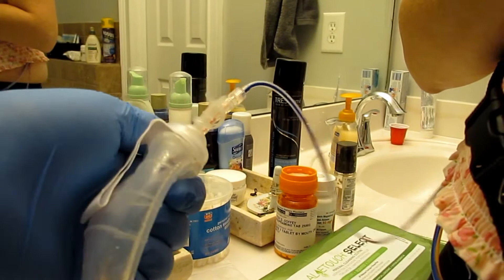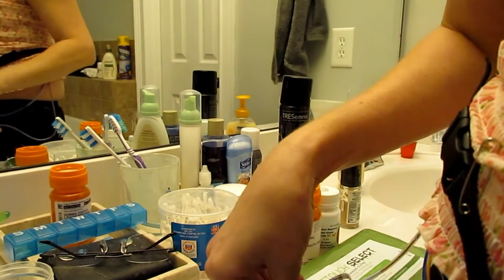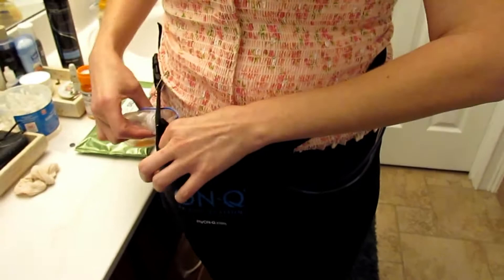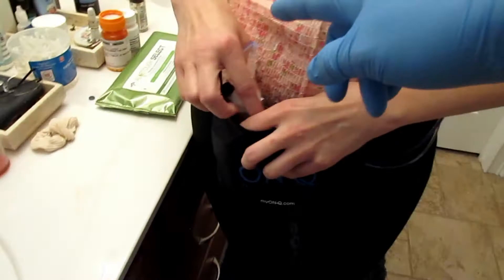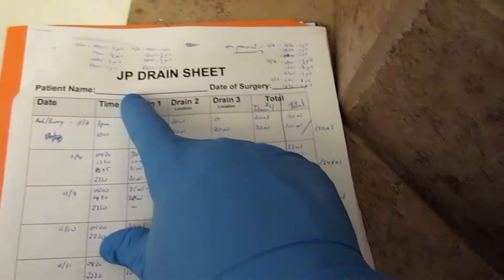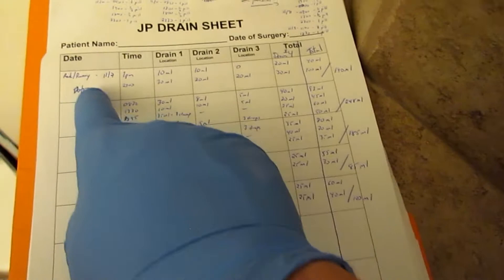Some people come home with two, four, or six drains — it just depends on the person. We're using this little fanny pack to hold them in. You can also pin them to your corset, or they make little cups on ribbons you can put them in. Then you have a JP drain sheet — since she's got four drains, we're putting the date, the times, how much came out of each drain, and then totaling it for the day.